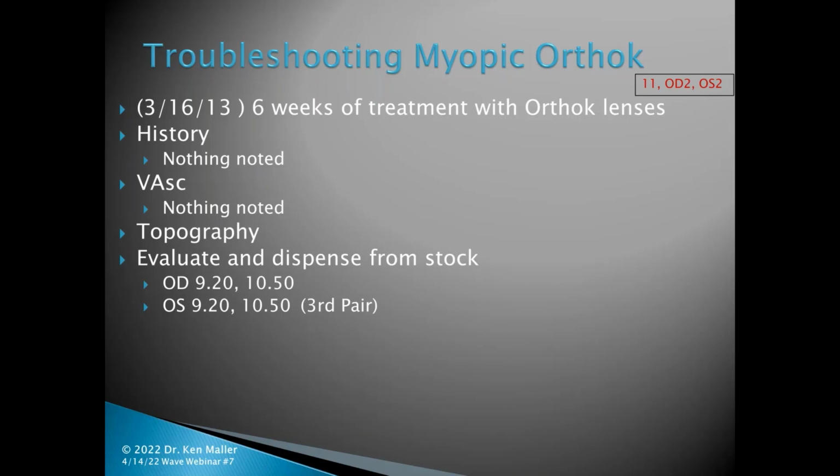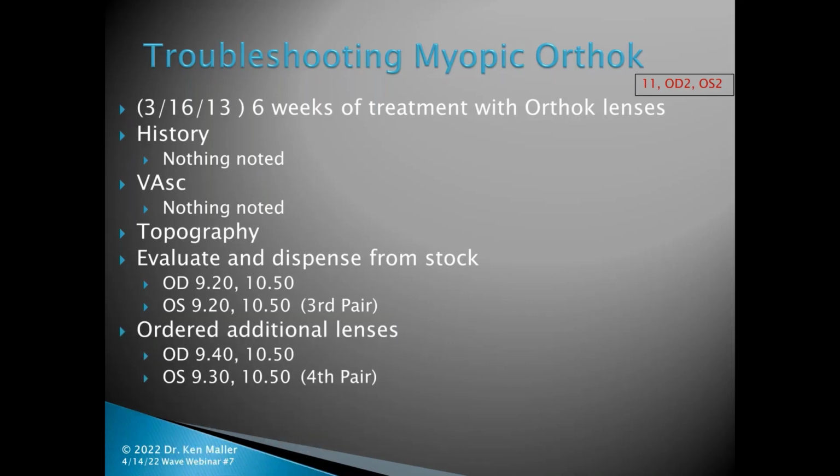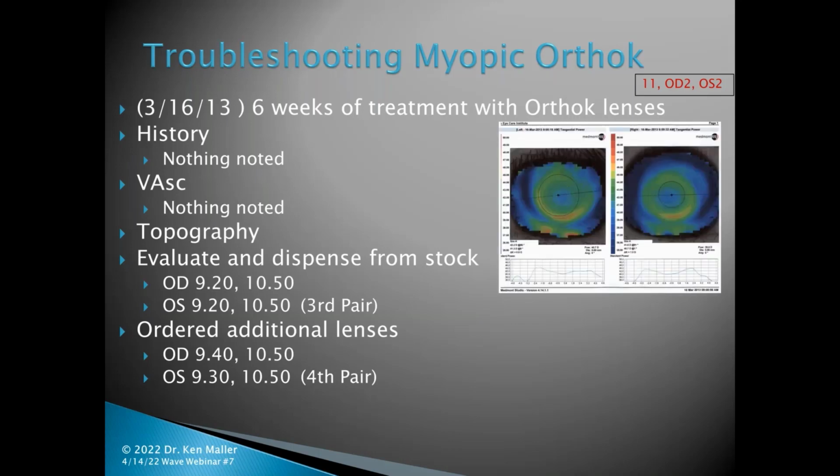Again, we're back up to 10.5 millimeter diameters, and now we're at 9.20 millimeter radius of curvature on the base curve. This is the third pair, and I guess they didn't really like the way those look, so they ordered an additional pair, which was the fourth pair, flattening out the base curve a little bit more, but leaving the diameter at 10.5. This was the topography on that day.